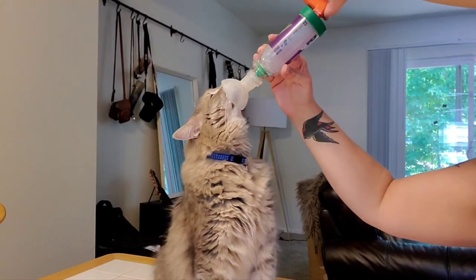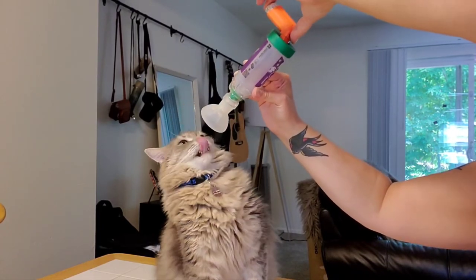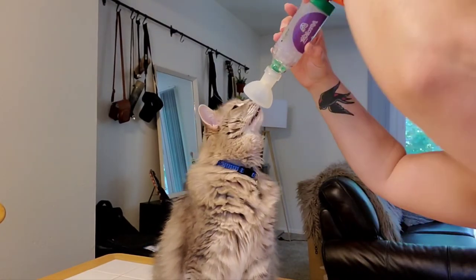He definitely didn't do it seven times, so I'm going to just repeat the process until he gets his seven breaths. Smokin' Joe, you're being a stinker. There we go. Do it again.